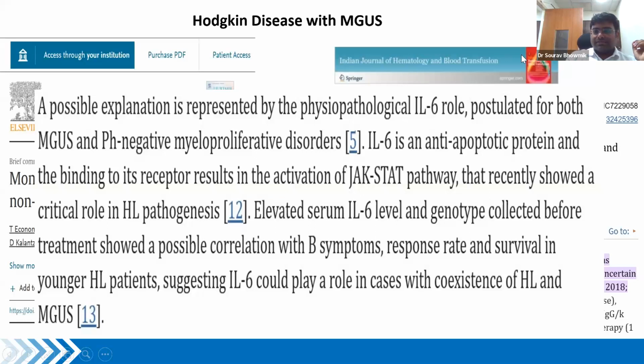Thank you, Dr. Saurav. I think this was a very interesting case, and it shows how hematolymphoid neoplasms can sometimes present with a different clinical picture, where we don't really suspect Hodgkin lymphoma, like in this case. Extremely good case, and very well worked up. Also, what was important was how you asked for a lymph node biopsy, because sometimes in a marrow, when you have very few RS cells, it can be very tricky.